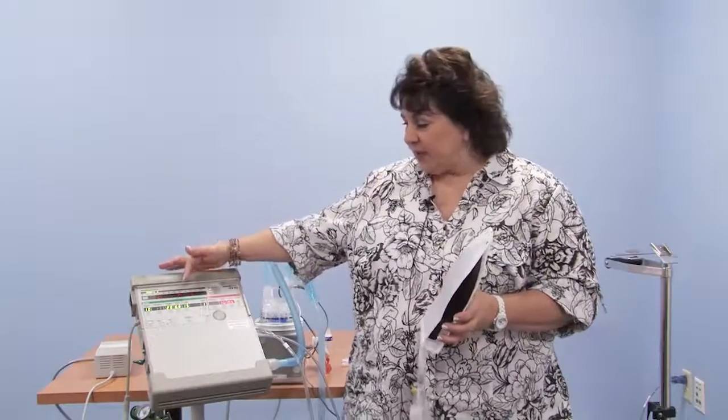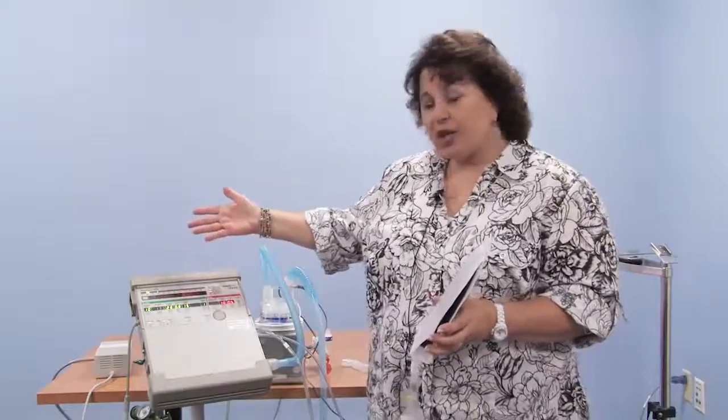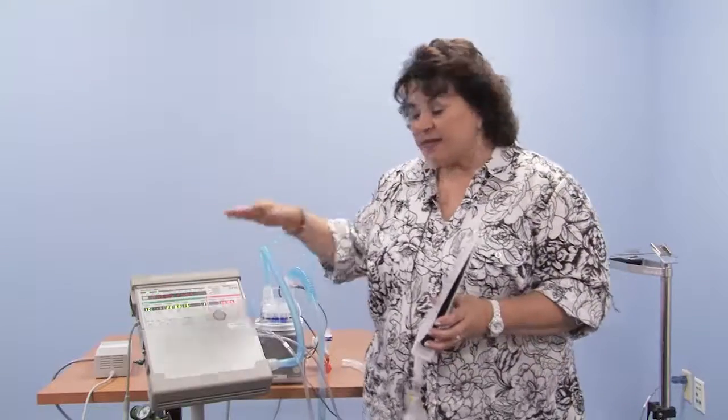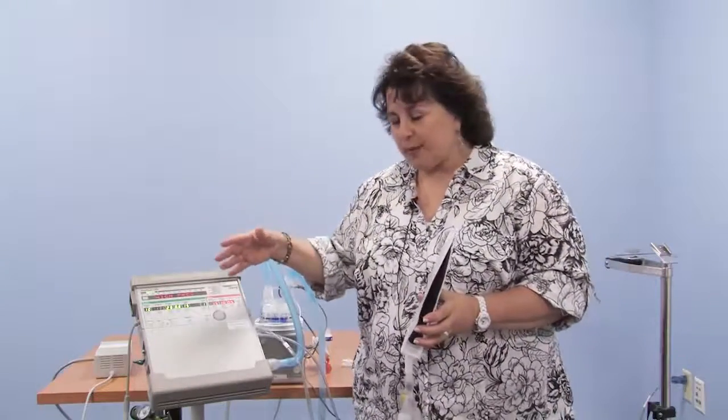But you may walk into the room and see this going on and you say, wow, I didn't hear anything. That's because it didn't happen a couple times in a row. If it happens once, it resets and everybody's happy. If it continues to happen and there's a reason why it's going off, it will alert you audibly. And this is a feature that can be enabled or disabled.